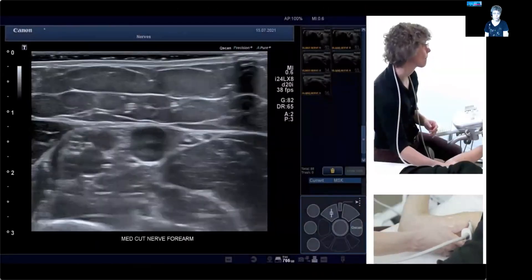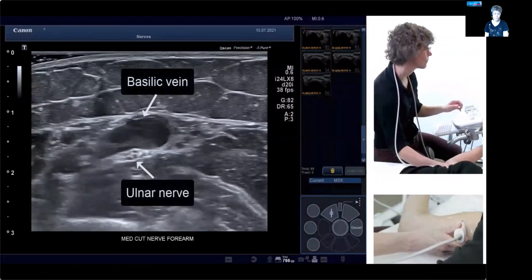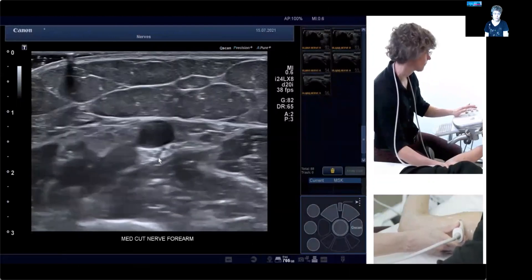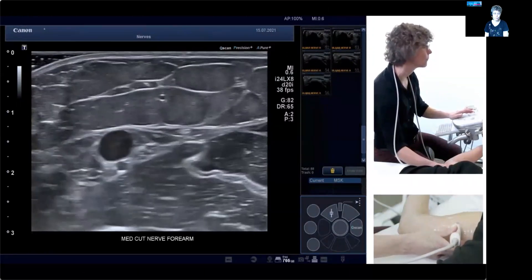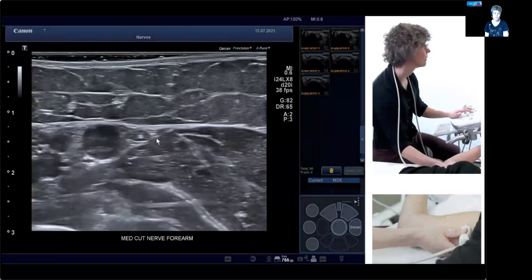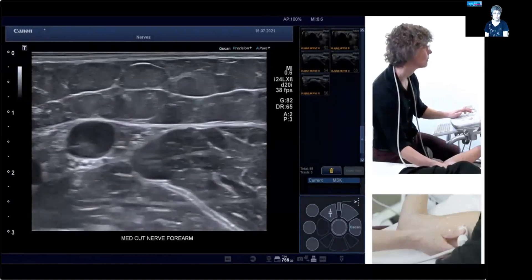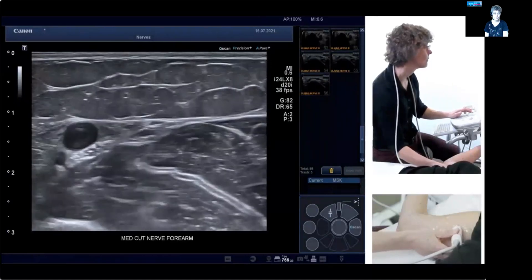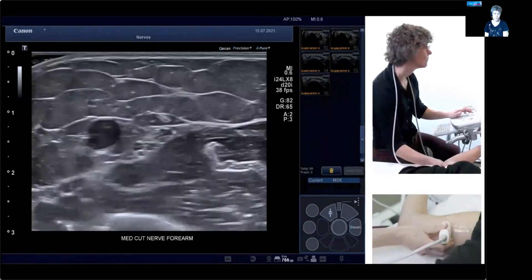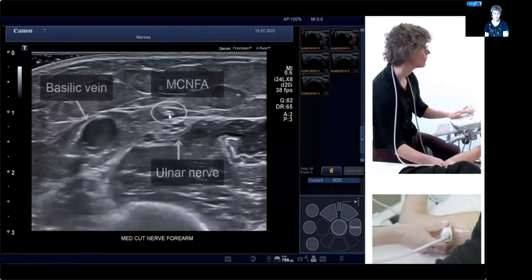We're going to put the probe here. You can see the ulnar nerve highlighted below that big vein. But if you look closely and move the probe a little bit, you can already see sensory branches running next to it — there's the medial cutaneous nerve of the forearm. It's usually in the vicinity of this large venous structure, always just above the fascial lining in the deeper layer of the subcutis. Now you see the ulnar nerve crossing it underneath, so they're right on top of each other.